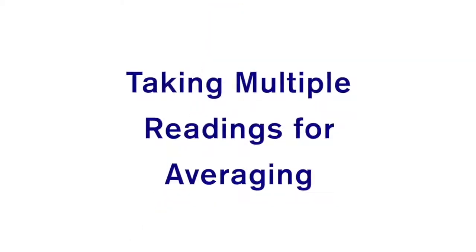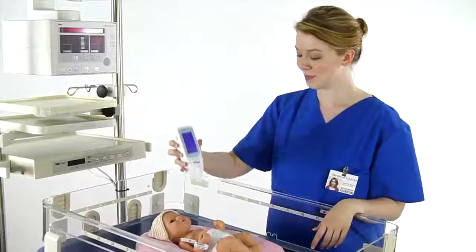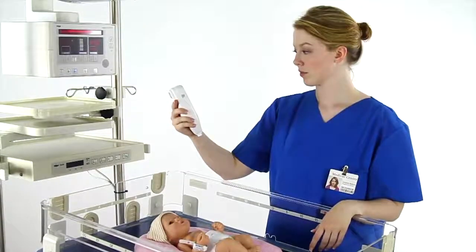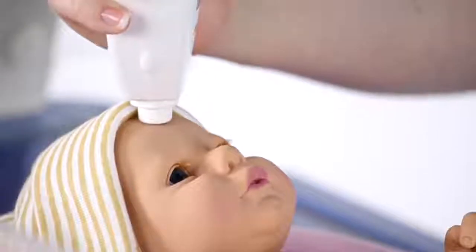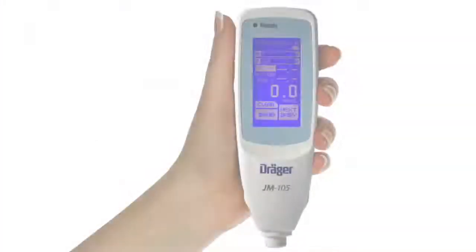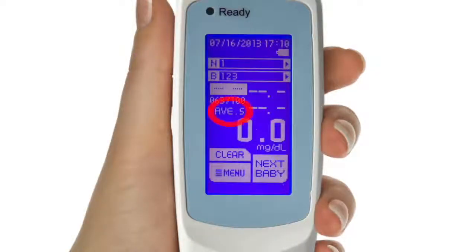We will now demonstrate how to take multiple readings for averaging. Taking between 2 and 5 readings gives a more accurate jaundice measurement. All of the measurements for averaging should be taken from the same location on the body, either the forehead or sternum. When you select Measure from the main display, you will see the letters A, V, E for average and a number, reminding you of the number of readings that must be taken with your JM105 to obtain an average measurement.